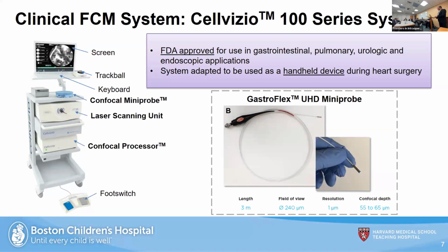The clinical system that we are using is the CellVizio, developed by Mauna Kea Technologies. It's called the CellVizio 100 series system. It's already FDA approved for use in gastrointestinal, pulmonary, urologic, and endoscopic applications. We are doing an off-label use.